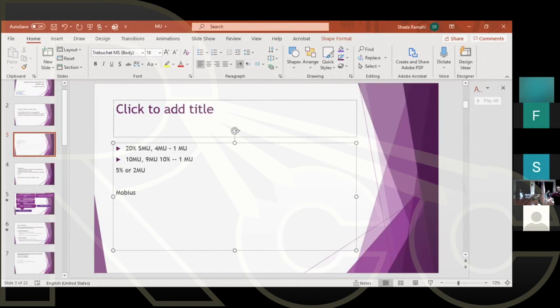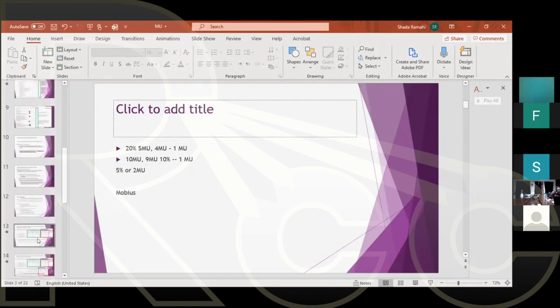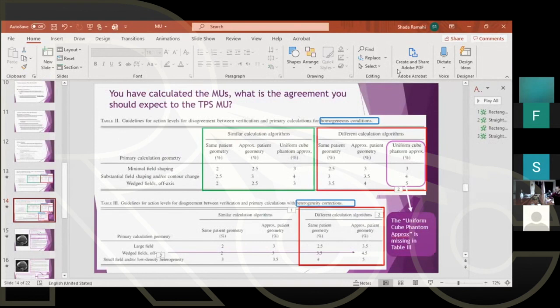5 minutes to calculate the complete plan, the isodose distribution with DVH, and it compares it to your TPS plan. So in this case, if you have this software, if you have Mobius, or a software that is doing second check based on CT dataset, and it uses CCC, by the way, it uses CCC, in this case you will be applying these parameters.